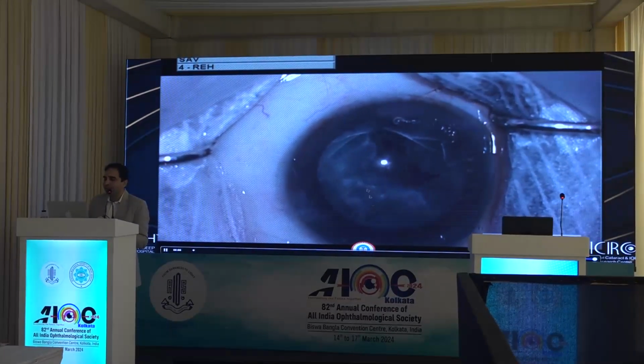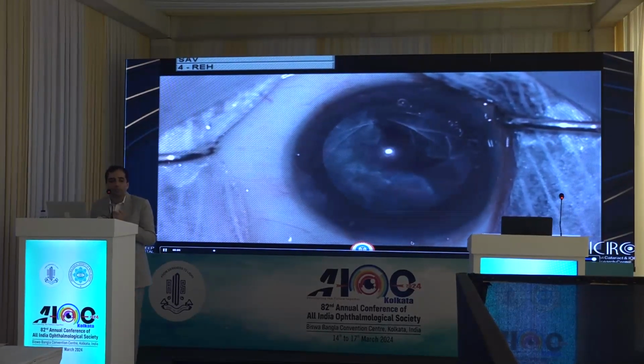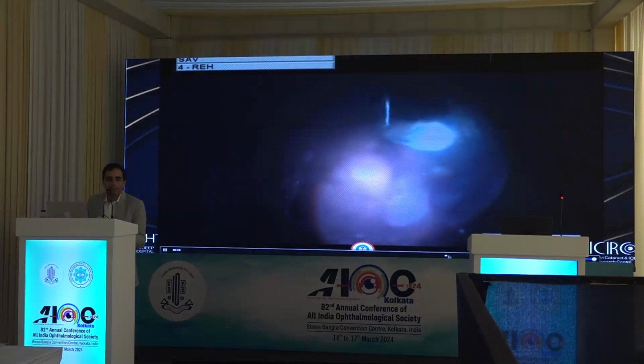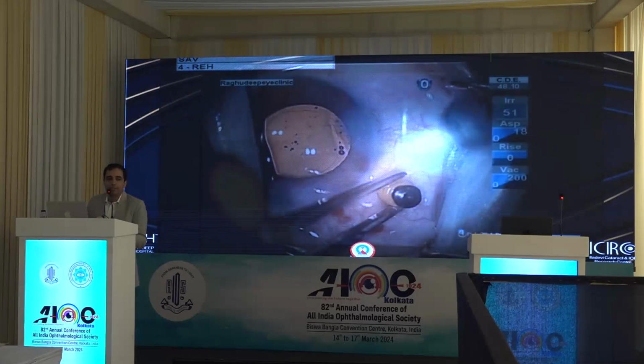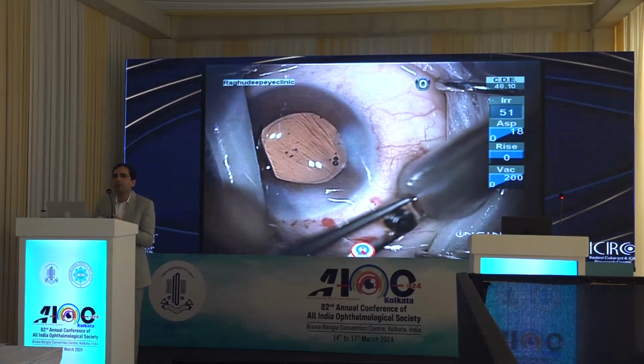But in most eyes, I would certainly recommend taking a suture at the main incision, even if it may be just a 2.2 millimeter incision. Just take a suture so that if the chamber is formed properly, it will be easier to make a pars plana entry.